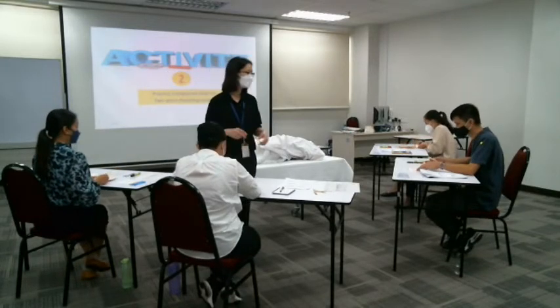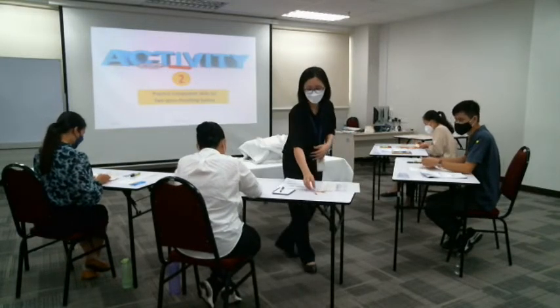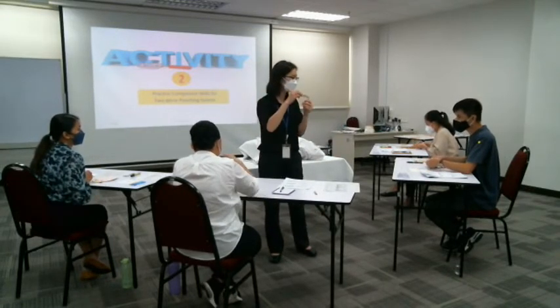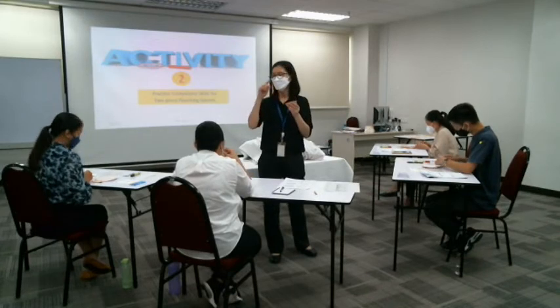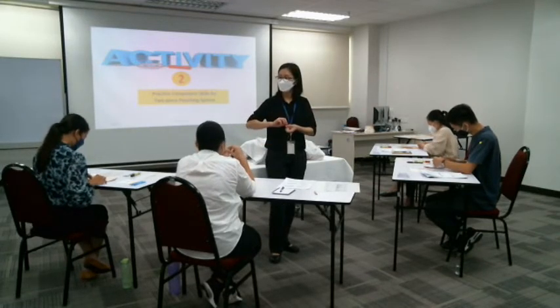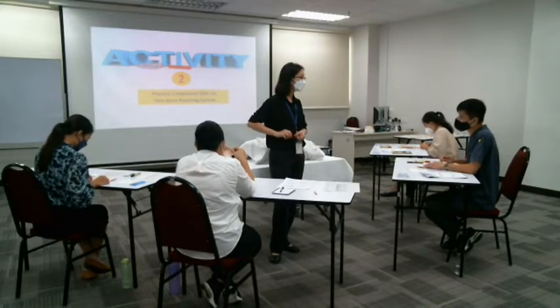Alright? So the tail closure, you also will have a click sound. Right? You also can hear a click sound. So make sure, sometimes the patient thinks that, oh, they took two folds so that it is more secure.